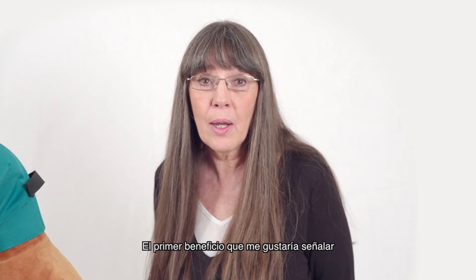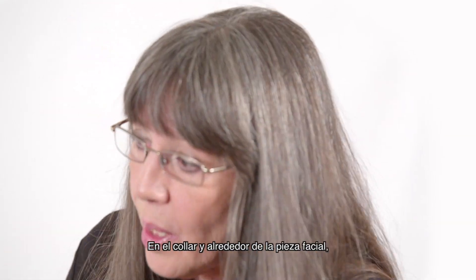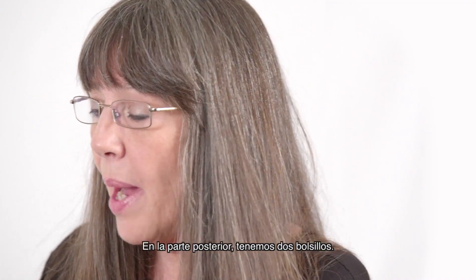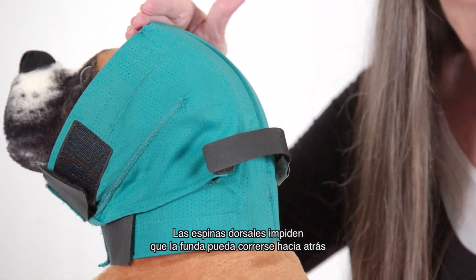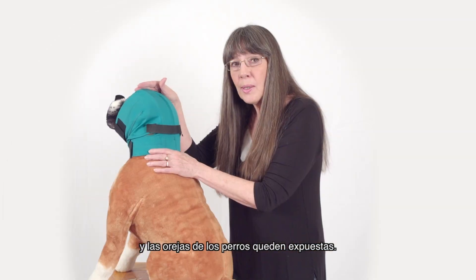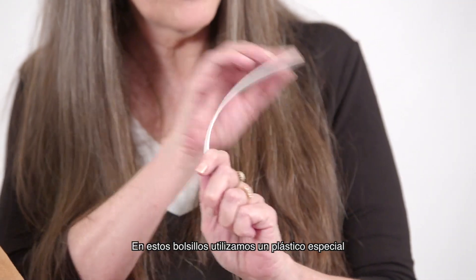The first benefit I'd like to point out is the skeletal structure sewn into each wrap. In the collar and around the face piece we have flexible plastic sewn in to maintain shape. Along the back we have two pockets. Each pocket contains a sturdy plastic spine. The spines are what stop the wrap from being able to be pushed back and exposing the dog's ear. We use a special plastic in these pockets that contains no memory to prevent bowing.